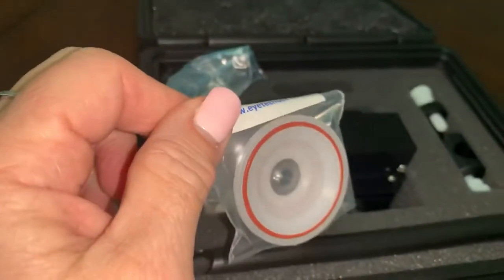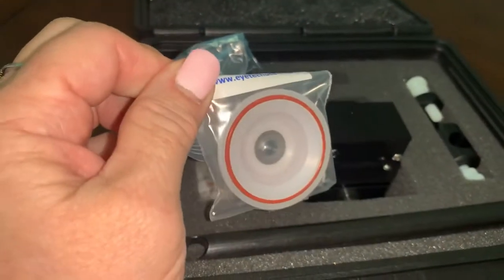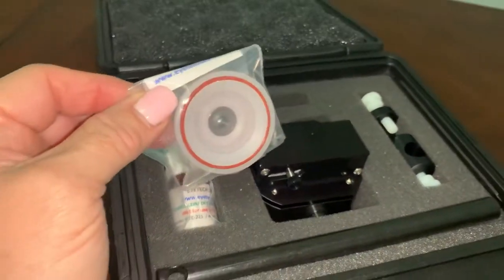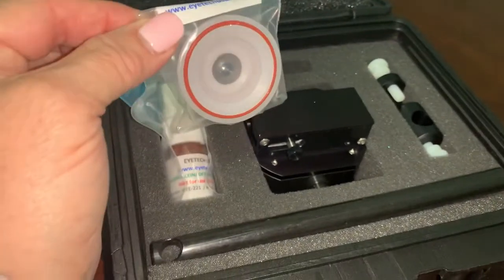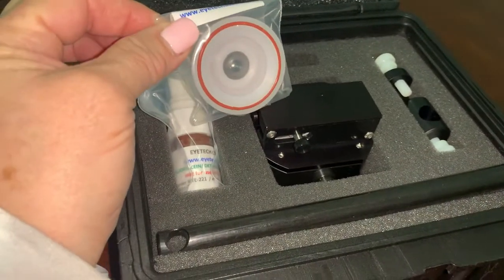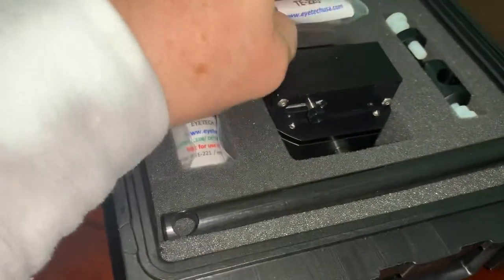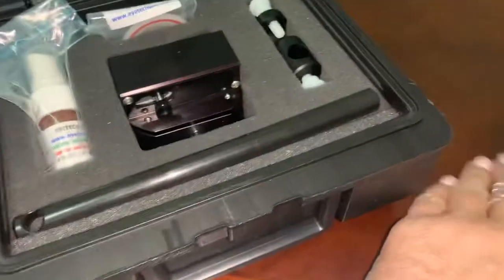This is a replacement cornea, which is really nice. Occasionally I have a student who will push too hard with the Goldman Tonometry Probe and will perforate the cornea, and then we have a compromised eye we can't use anymore. So I always like to have a spare cornea with me when I train.